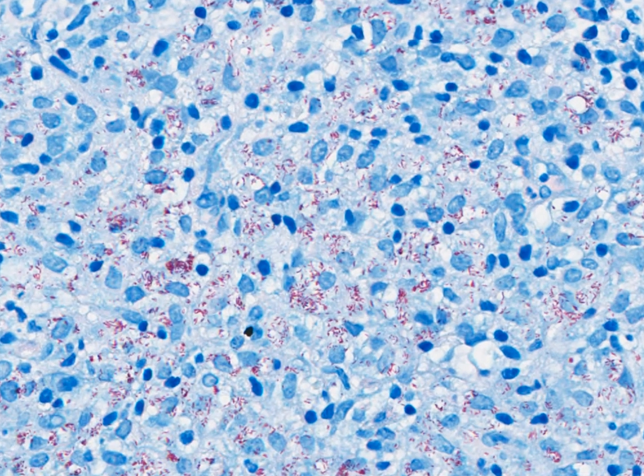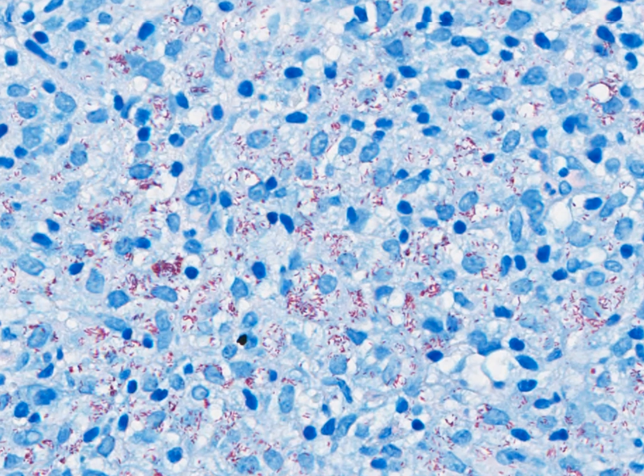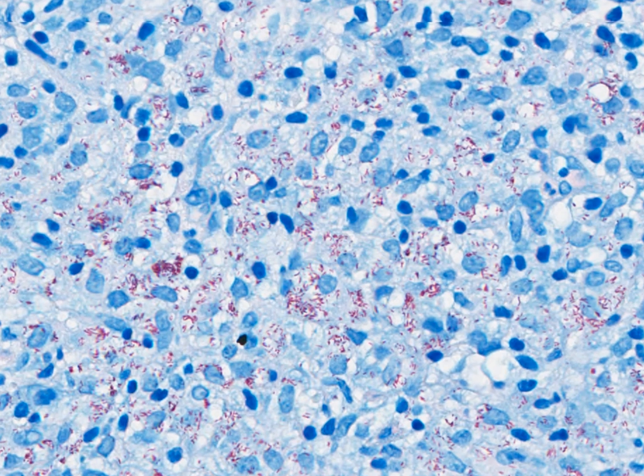You might consider malachoplakia on H&E, but there is nothing that looks like a Michaelis-Guttmann body.